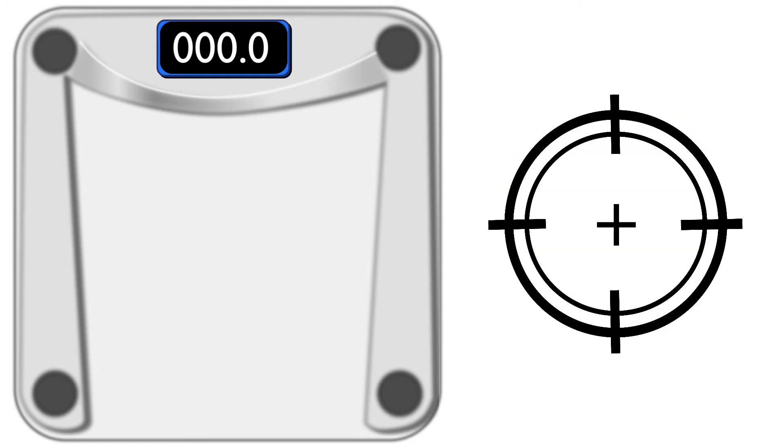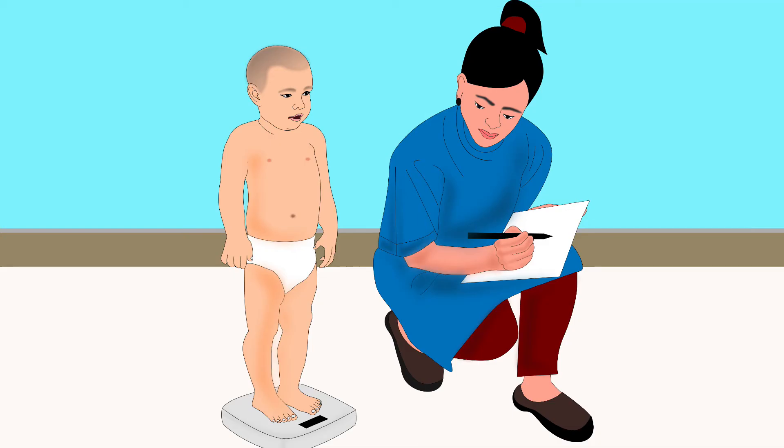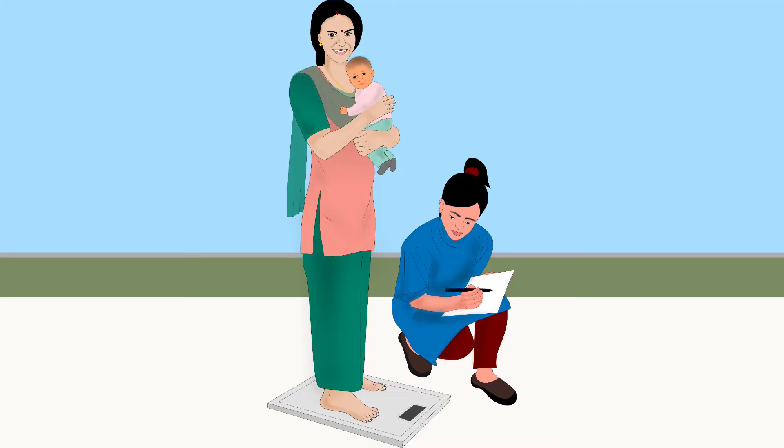Next, let us learn how to measure weight using a family digital scale. Digital or electronic scales provide quick, easy, and precise measurements. Family digital scales can be used in two different ways to weigh children. Children who can stand up can be weighed by making them stand on the scale. Other children can be weighed in the arms of an adult — this is also called double weighing.